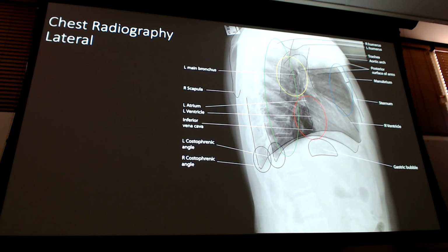And because it's a left lateral and magnification and projection, my right diaphragm, hemidiaphragm, is farther away from the film. That's why it's a little bit higher, because it's slightly magnified compared to where the left one is on the lateral, right? Because left's up against the film, so it hits right first. It projects it a little bit more.